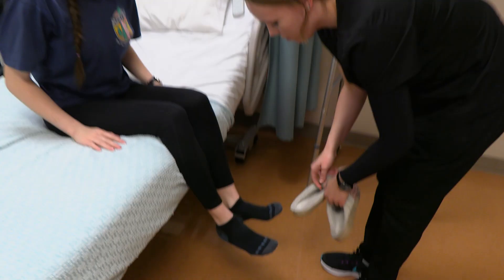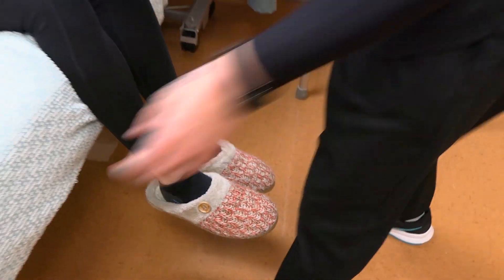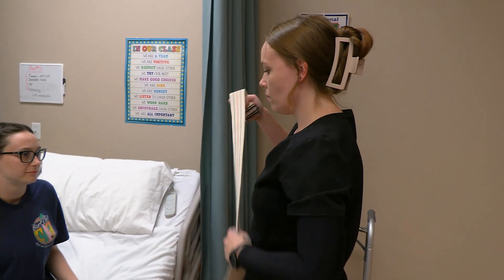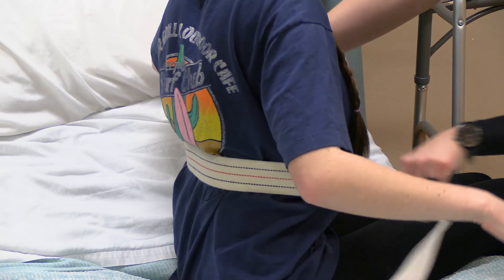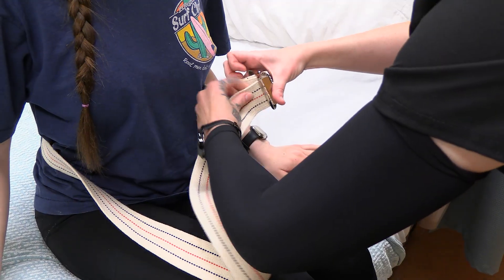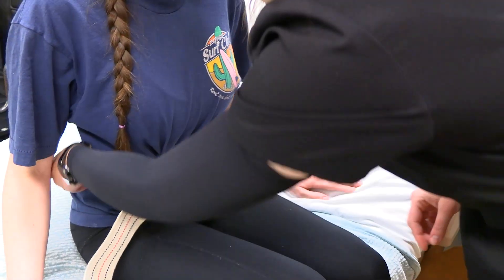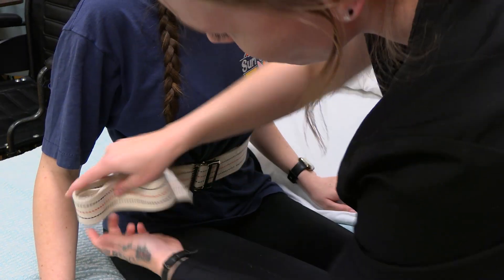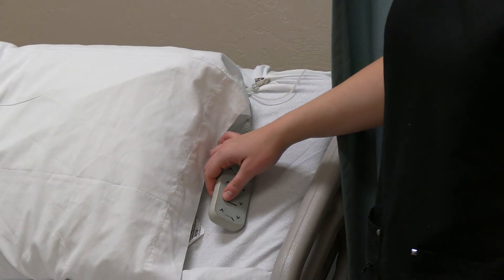I'm going to apply your slippers and the gait belt. Can I have you raise your arms, please? Thank you. I'm going to be applying the gait belt above the waist but below the ribs. I'm making sure that two fingers fit comfortably. I'm going to lower your bed, Ms. Sophia.